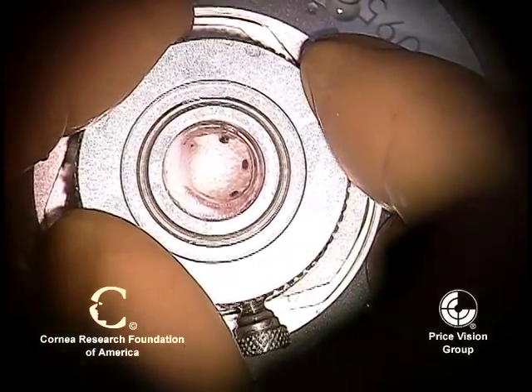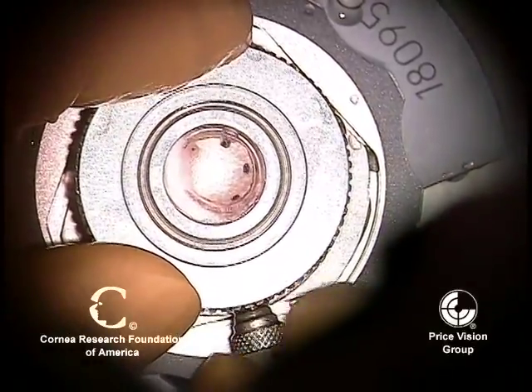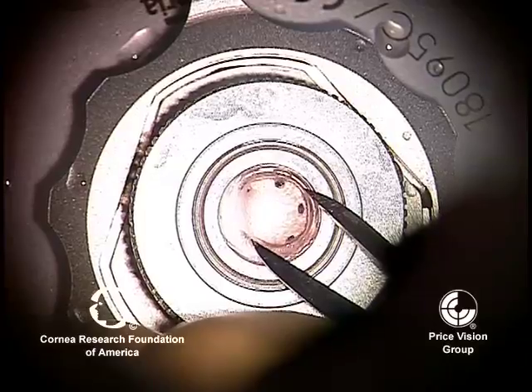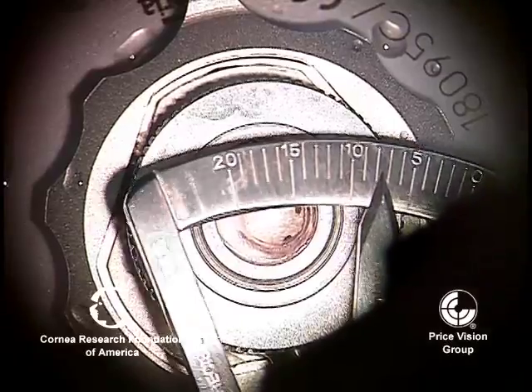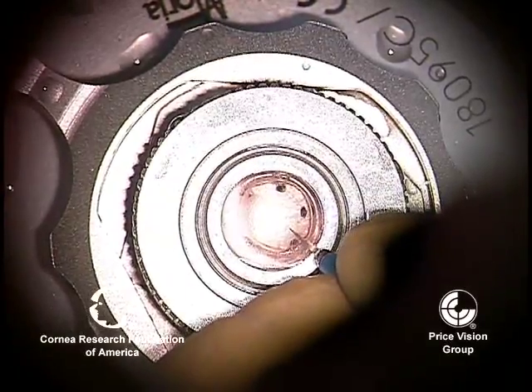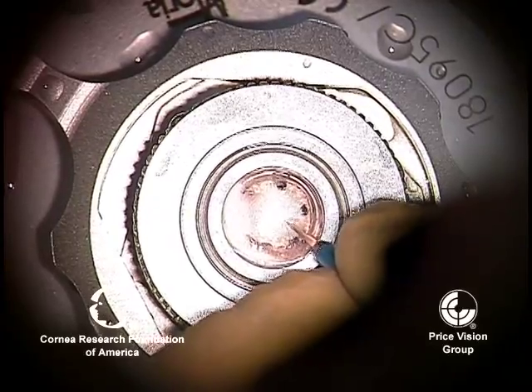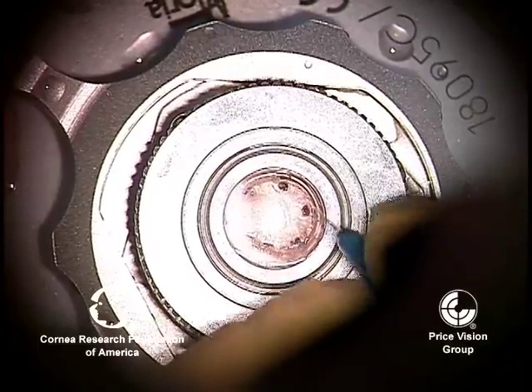We're going to fixate it, and once we do that, we're going to use a 15-degree blade to incise the stromal side of the big bubble. We're actually measuring the width of the big bubble now. When we incise it, we're going to try to make a fairly good cut. This is different than when you do it with a deep anterior lamellar, because there's no back pressure on the artificial anterior chamber — Descemet's stays posteriorly.